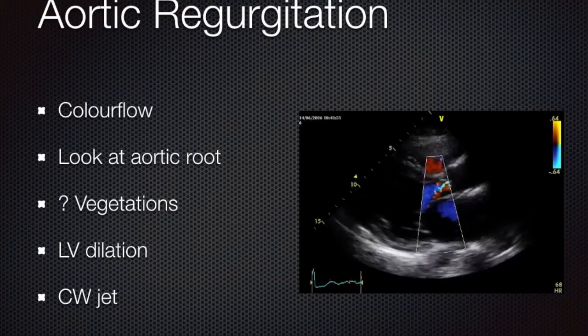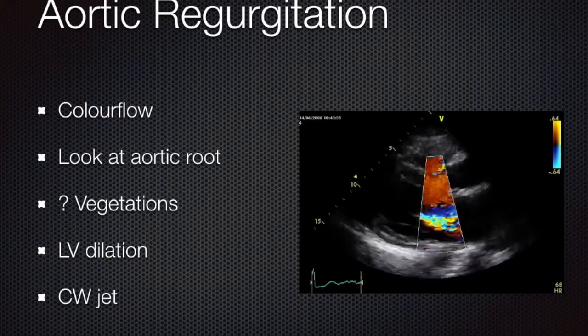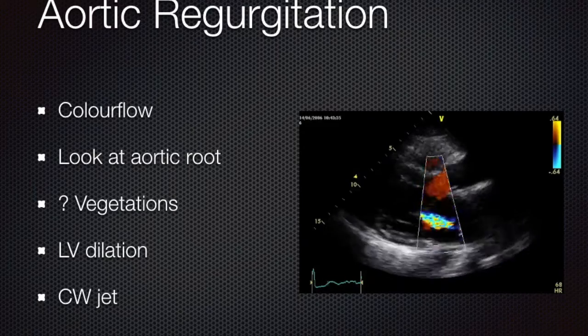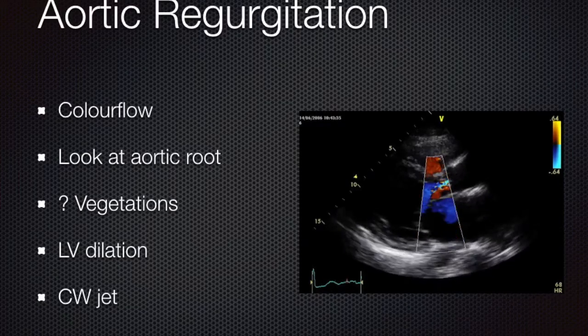Okay, so just a few more images really to look at aortic regurgitation, and sometimes it might be due to vegetations or other things that make the aortic valve not sealed properly during diastole.